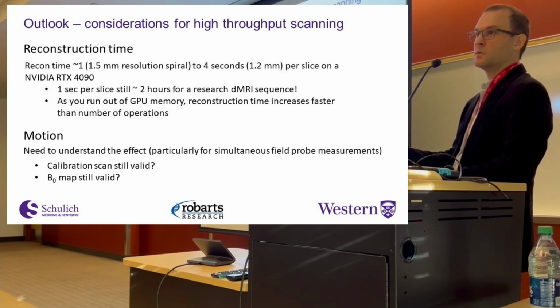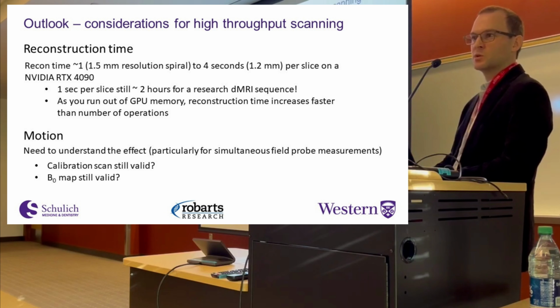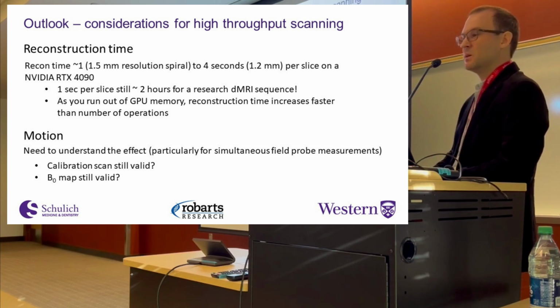So far, probably most scans, at least in my lab, it's all been grad students that just go and fall asleep in the scanner. If you have a patient in there, I think you might end up with inexplicably worse image quality, but maybe it's from motion.